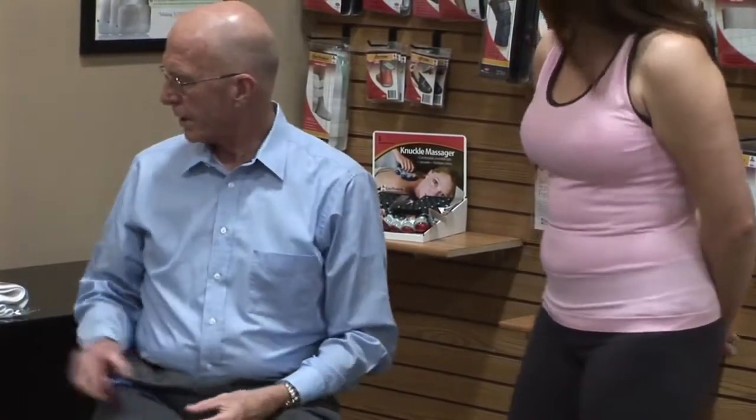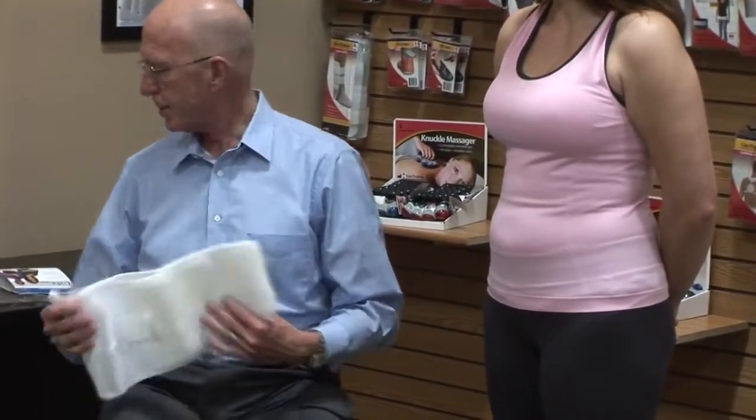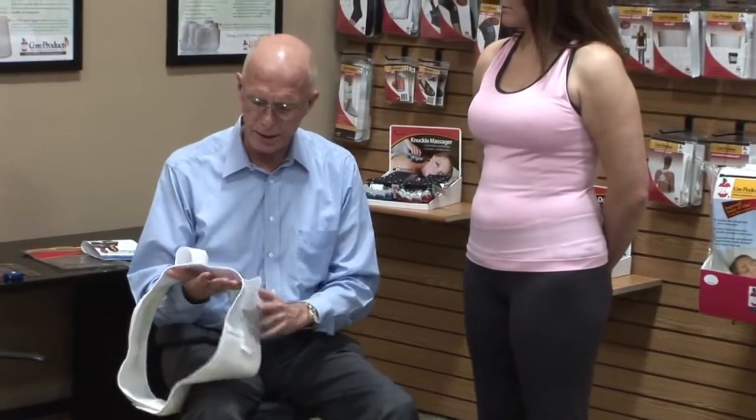This happens to be a size medium-large. One of the unique features of this product is that you can fit well over 90% of your patients in just three sizes, because as the sizes go up the height also increases — they're all progressively sized. That means you can fit a broad assortment of patients with very minimal inventory. Three sizes fit most, with options for larger sizes as well.